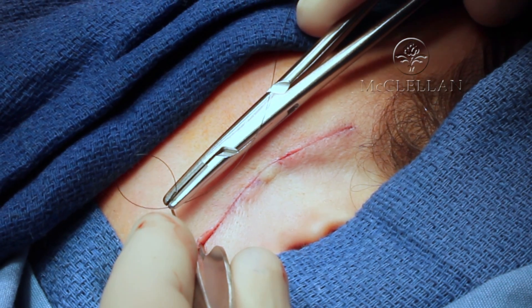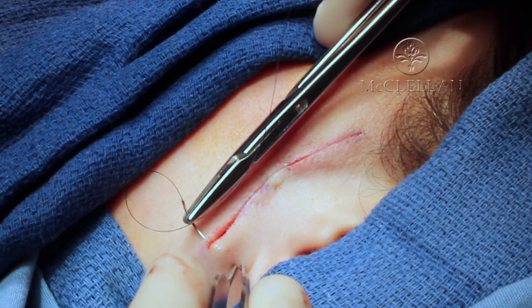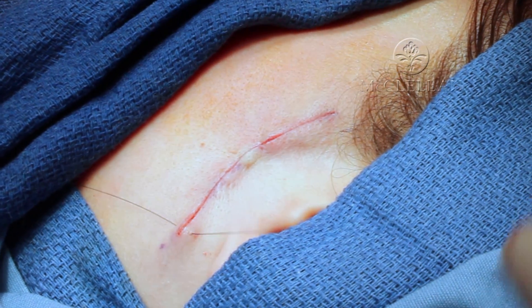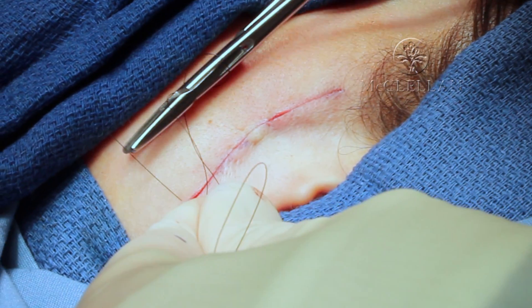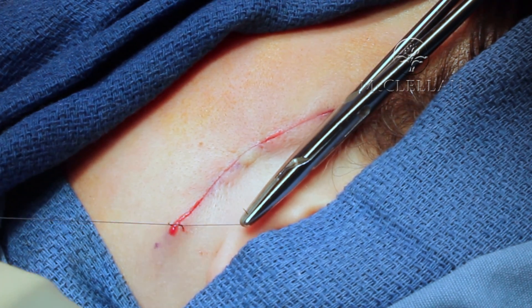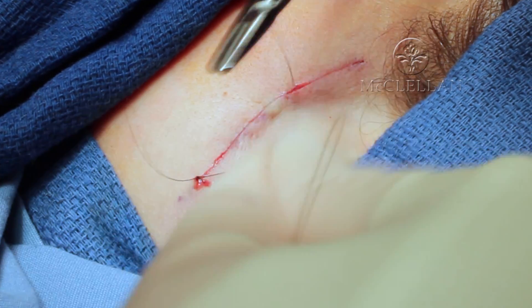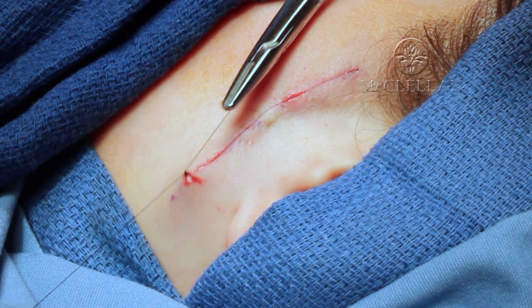Here we are in a live patient. I've already put in the deep dermis — as you can see, the skin edges are well brought together. I take my simple bite across, equidistant on both sides. And as you notice, I'm not fighting the needle. This is a 5-0 nylon and I'll put five throws in the knot, but I'm not fighting the needle, I'm not twisting the wrist, and I'm not twisting the tissue. That's very important because every time you fight the skin, you're going to damage the skin further than you need to.